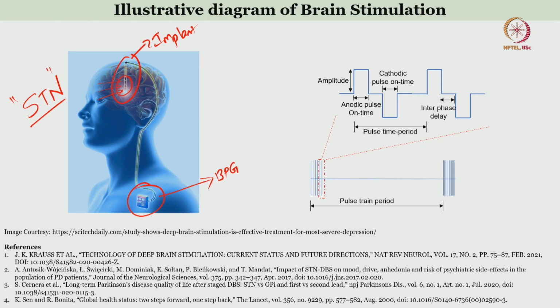But there are side effects using this. So, there is a need for neurosurgeons to find an alternate region for deep brain stimulation in order to benefit the patients. Currently there are different targets, like the pedunculopontine nucleus (PPN), the GPi, and of course the STN, which is already chosen. Research is going on with PPN and GPi to find the best alternative to STN. This is the typical application.